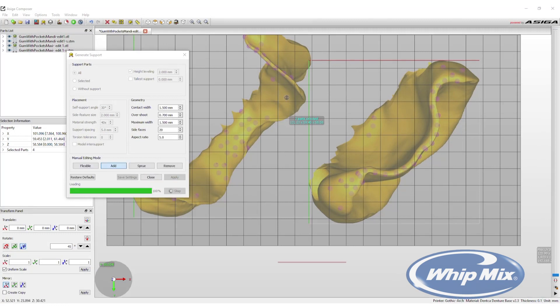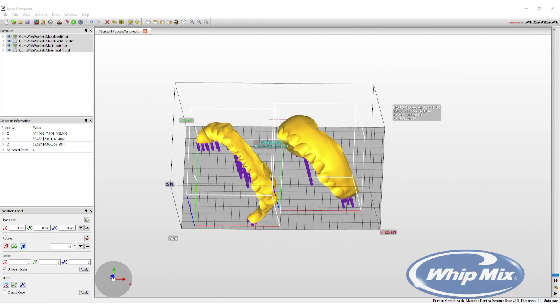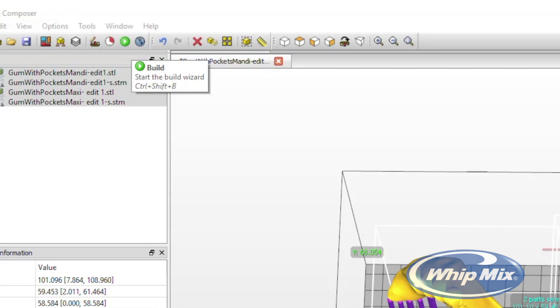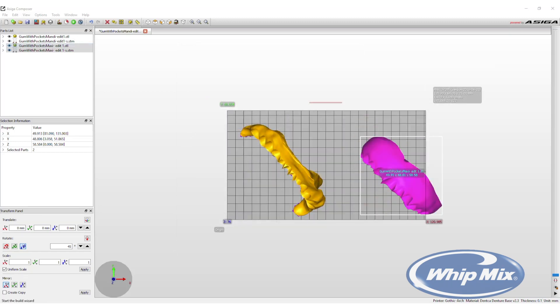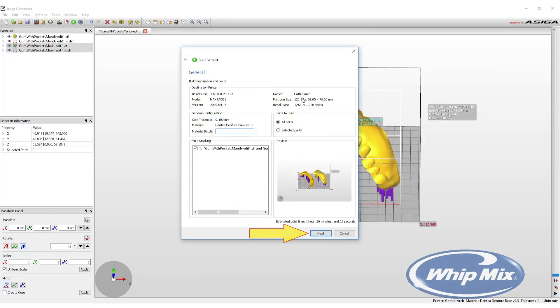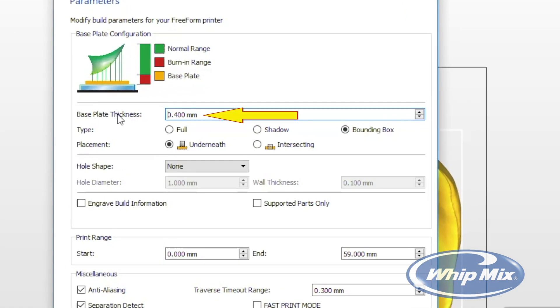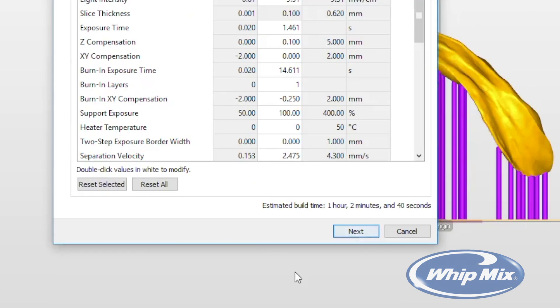When satisfied with the supports, close the Generate Supports menu and do one final inspection before sending the build to the printer. Press the Build option — the green circle button with a triangle inside — to open the Build Wizard. All build properties can be viewed here. A warning will appear if portions of the print are outside the build box. Select Next. The next step is to add a base plate — the default thickness is 0.4 millimeters and Shadow is the type to use. Fast Print Mode is available for the ASEGA printer; it is not mandatory but provides a solid print in the shortest time. After choosing settings, press Next.